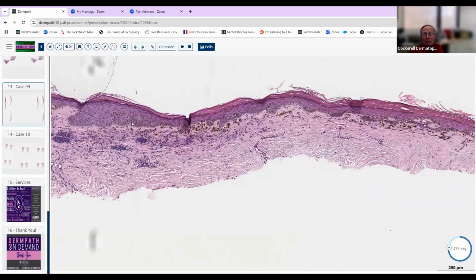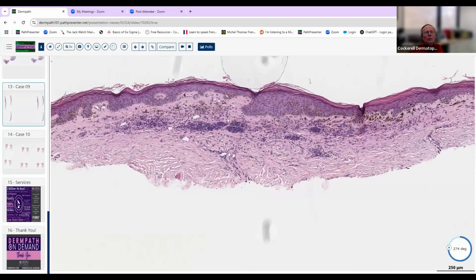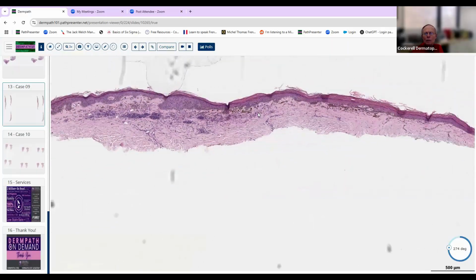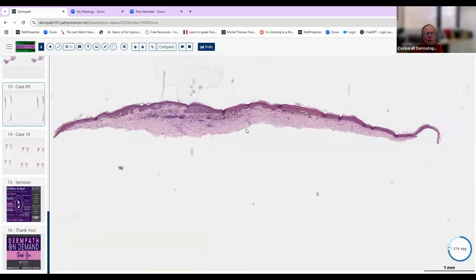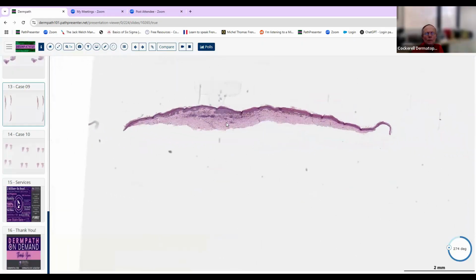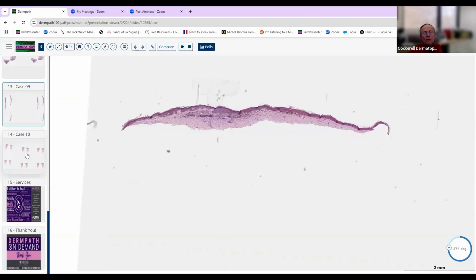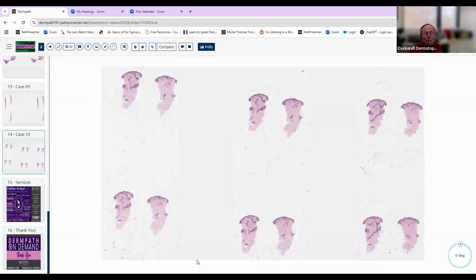And they might put malignant melanoma down as a choice and expect you to recognize that this doesn't look like malignant melanoma at all. It's a pretty straightforward benign lesion and doesn't really show anything, in my opinion, that would be of any concern for the diagnosis of melanoma here. So this could be a solitary lesion in somebody that has no history of malignant melanoma. It could be a lesion from a patient that's maybe had melanoma before, or maybe he's got a first or second degree relative with melanoma. So, nice example of a compound type of dysplastic nevus, and that's kind of how you approach that.